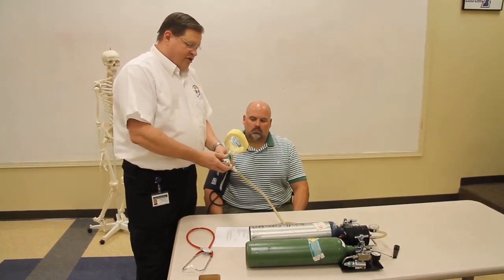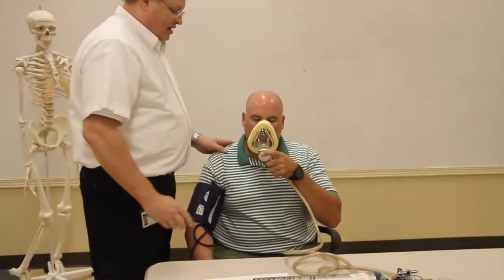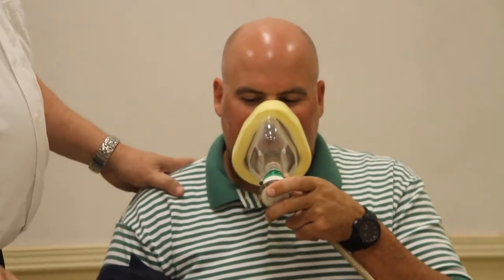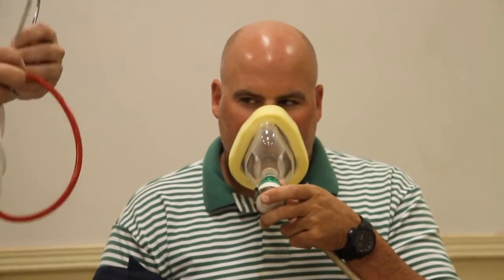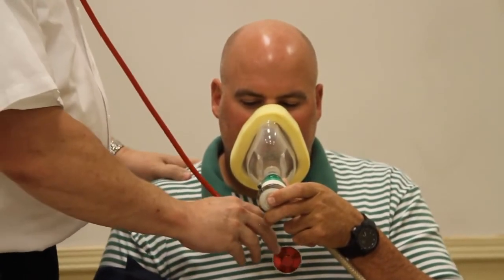So we're going to explain to Lee, I want you to hold this on, take good deep breaths, and then let me know if you're feeling any pain relief. While he's taking those deep breaths, I'll also put back on my stethoscope, and I will again listen for breath sounds as he's taking those deep breaths in and out.